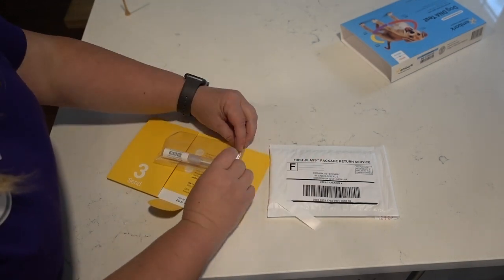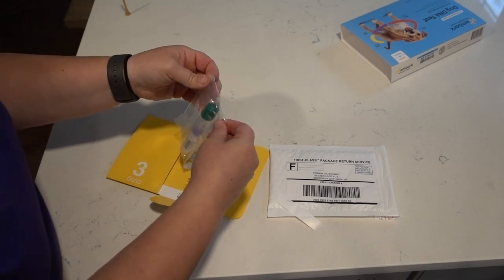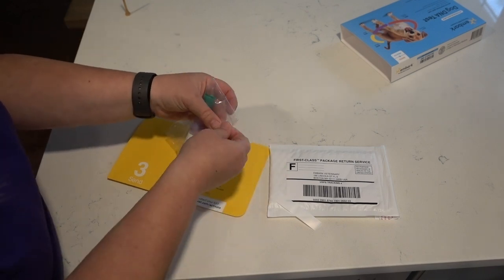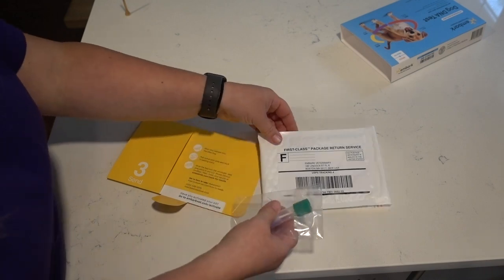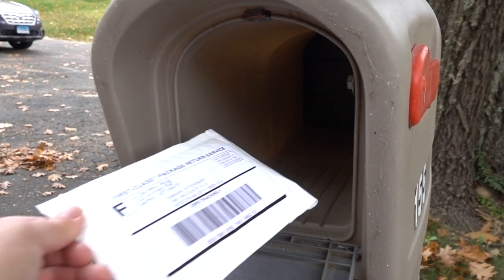Then place the sample in the clear plastic bag into the pre-packaged envelope that already has shipping on it. Seal it and place it in any U.S. Postal Service mailbox for pickup.